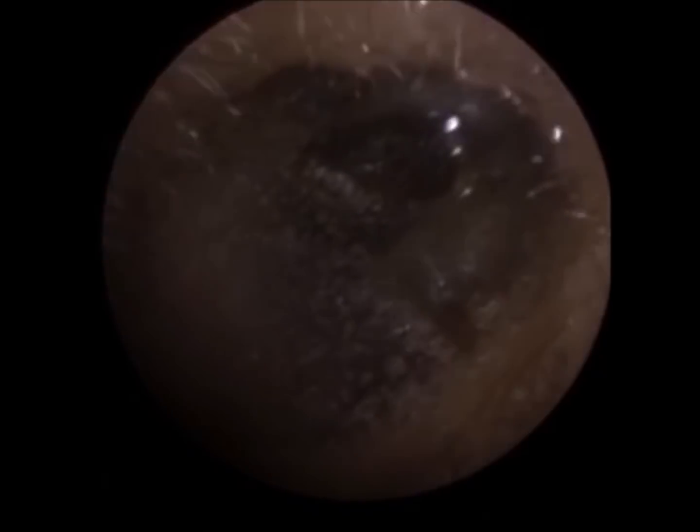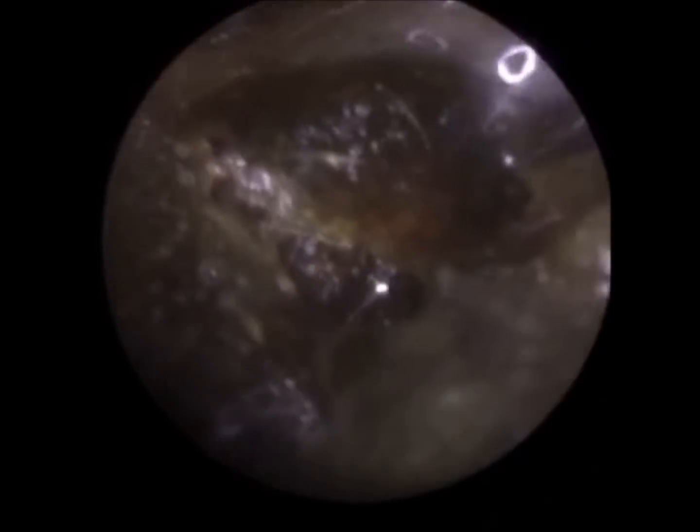Just going to the roof of the ear canal there, there's some keratin, just trying to loosen that bit, and this is where I've put some olive oil drops just to lubricate it. I tend to use olive oil in the same way you would use some soap. If you've got a ring stuck in your finger, it just provides that lubrication, and because the wax was a bit stickier on this side, the olive oil helped improve the suction grip.